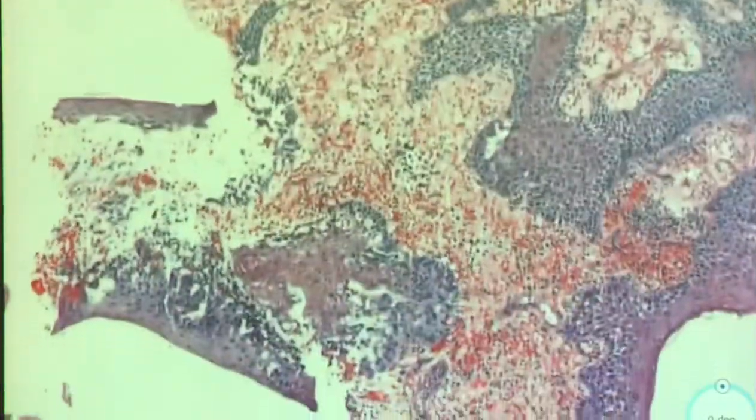So this is case 10, our last case. More biopsy fragments, ugly looking cells. Is there invasion? I think there is. It's kind of off kilter, and these pieces are not very useful, but I think this piece is nice because you have these places going down here that's detached.